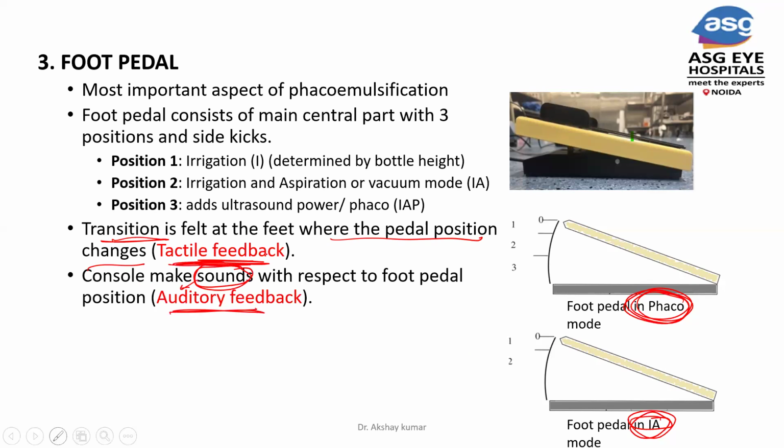So I would advise our fellows that if they want to learn Phaco or if they want to start Phaco, then they have to work on these feedbacks in any small bowl or any kidney tray, to learn the tactile feedback and auditory feedback, and then switch over to the patient.